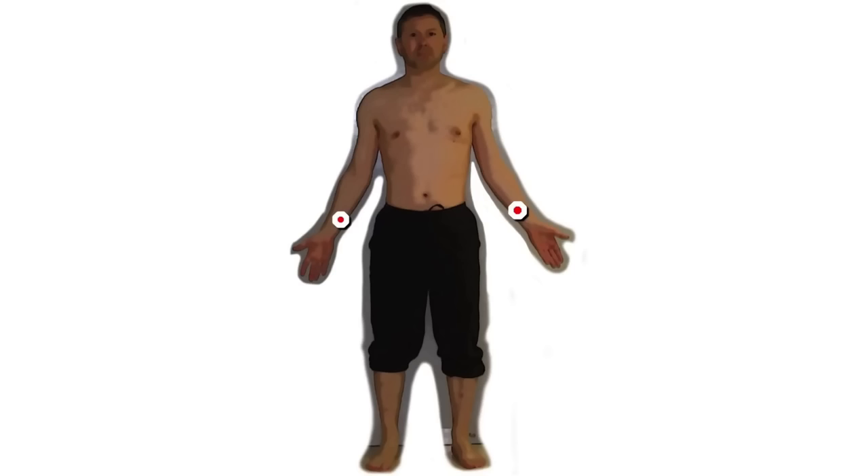However, if the patient is tremulous, then I would move more proximally to limit the amount of interference caused by the tremor. For the lower limbs, I just tend to use the medial aspect of the lower half of the tibia.